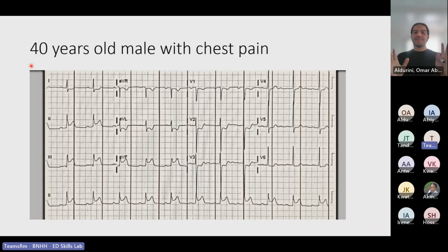Seems yes. Logic. Perfect. Apply this, but in electricity. If the ST segment here is coming up, okay, so in any area of the heart, if the ST segment is coming up, this means it's coming closer to the camera or to the lead here, for example, to lead 3. It's coming closer to lead 3. And this means it will go further away from another camera, which is another lead.